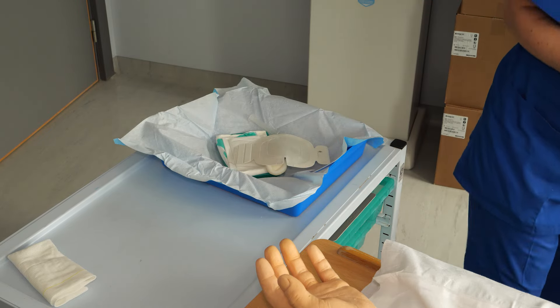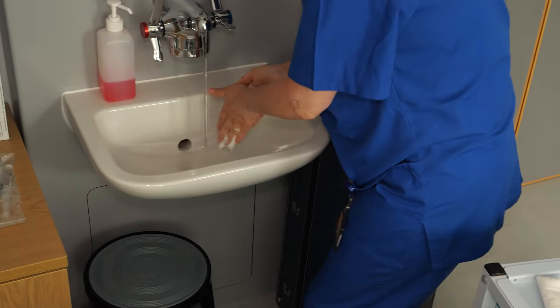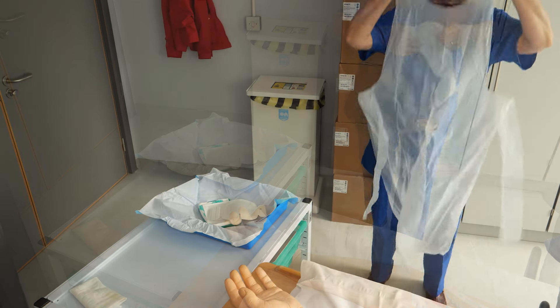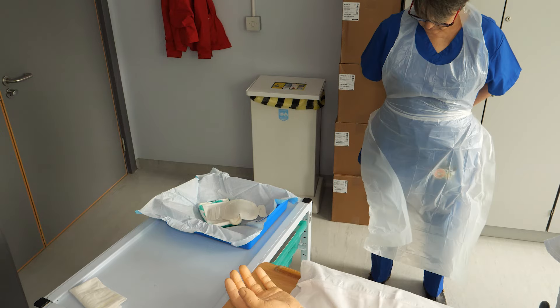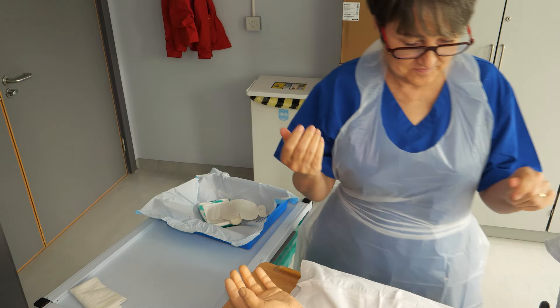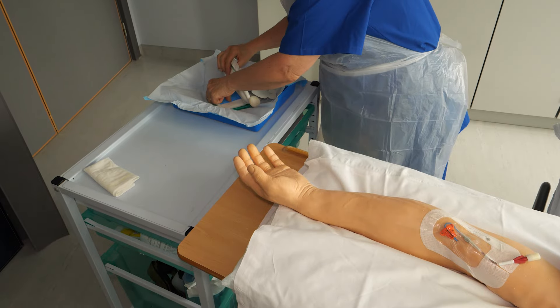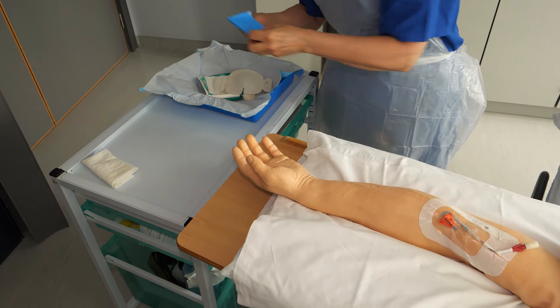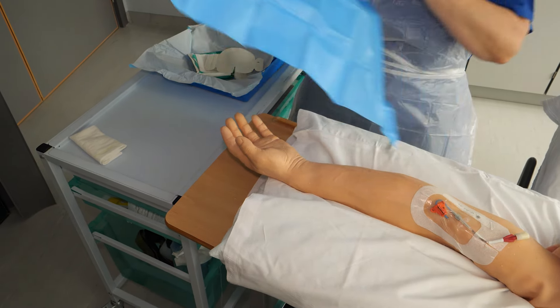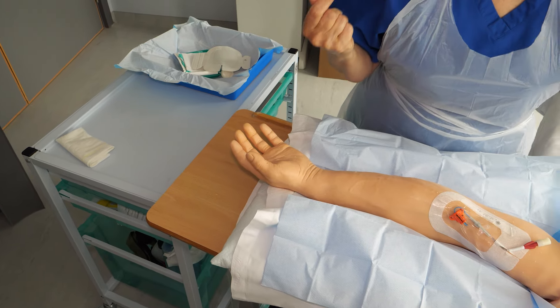Check you have everything you need and wash your hands. Carefully pick up the apron from the tray and put it on. Now place the blue sheet under the arm with the PICC line. You are now ready to start the dressing change and flush.